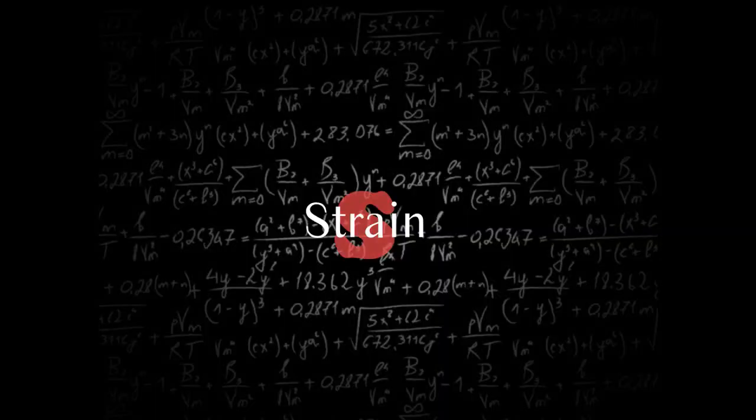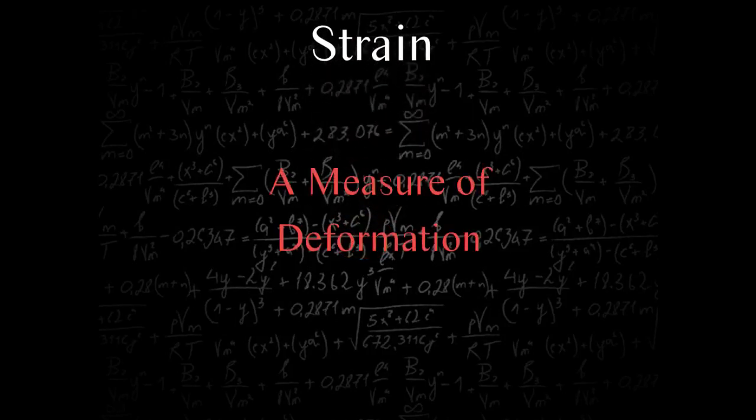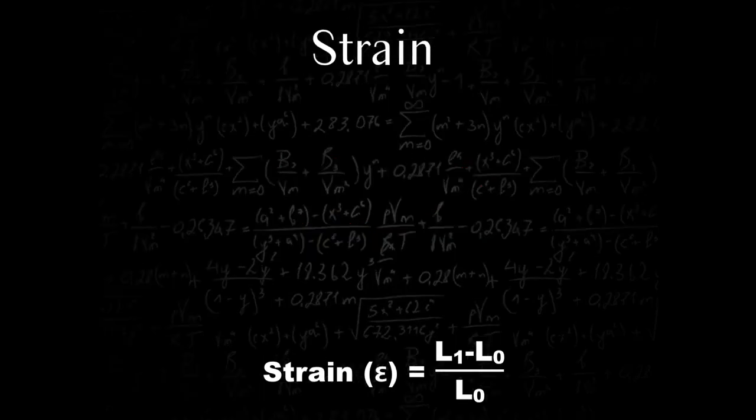Well, what if we could measure or quantify this deformation in some way? Quantify how much one region of the myocardium is deforming compared to another. And the answer takes us out of the realm of medicine, and into the world of physics, where, simply put, strain is a unitless measure of deformation. And it's represented by a single equation, which you see at the bottom here, and we often express it as a percentage. And again, this concept is also simple.